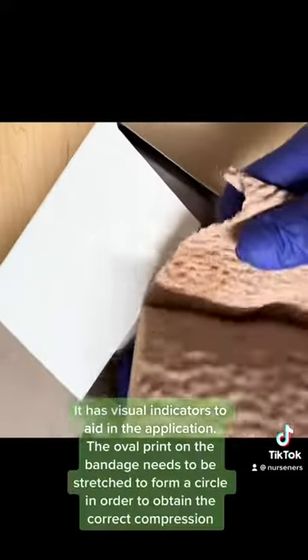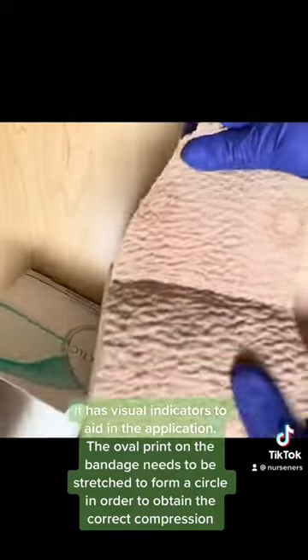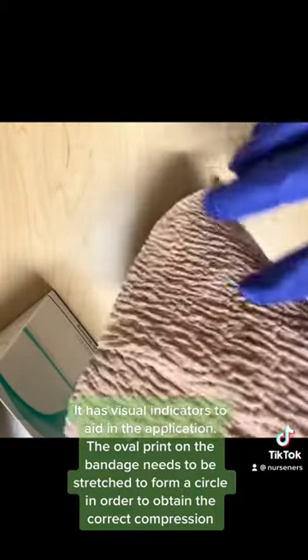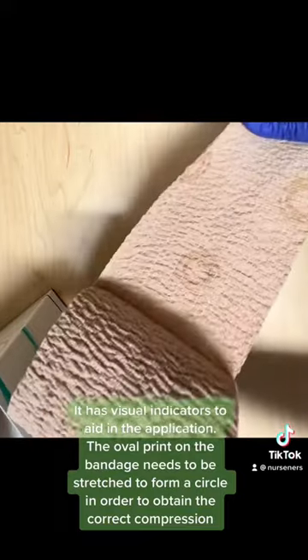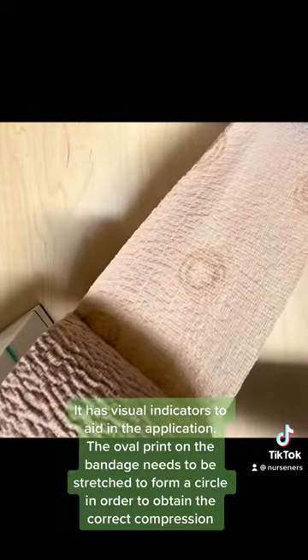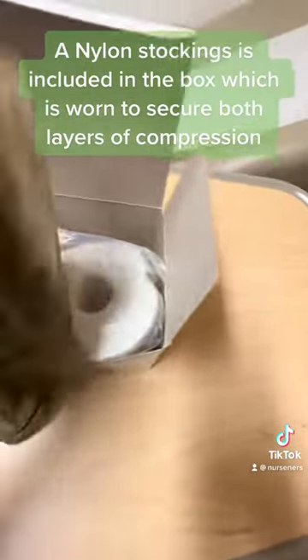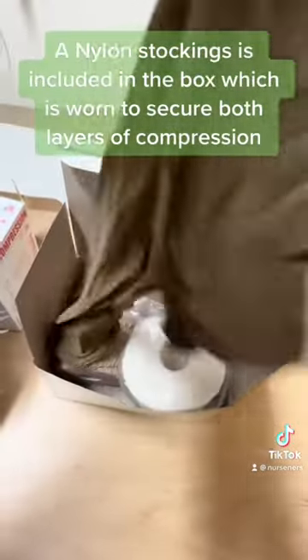It has visual indicators to aid in the application. The oval print on the bandage needs to be stretched to form a circle in order to obtain the correct compression. A nylon stocking is included in the box, which is worn to secure both layers of compression.